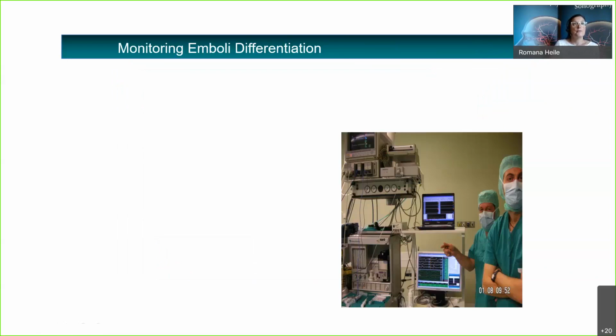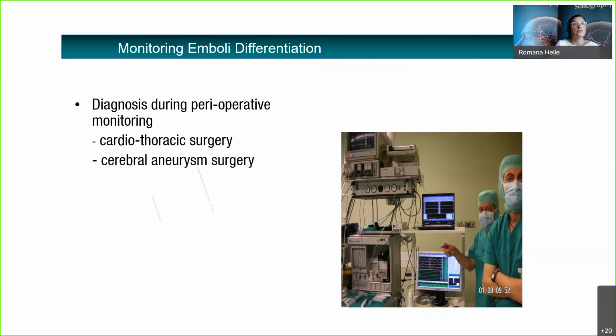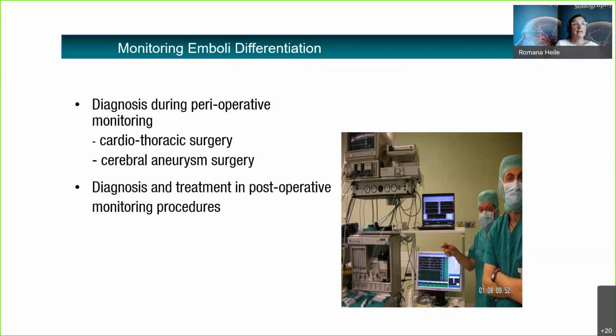As mentioned before, there are many good reasons to look for the differentiation between solid and gaseous embolism, and that will lead to quality control during surgery, specifically cardiothoracic surgery or cerebral aneurysm surgery. It can also be used for diagnostic and treatment in post-operative monitoring procedures, and also for pre- and post-stroke evaluations.